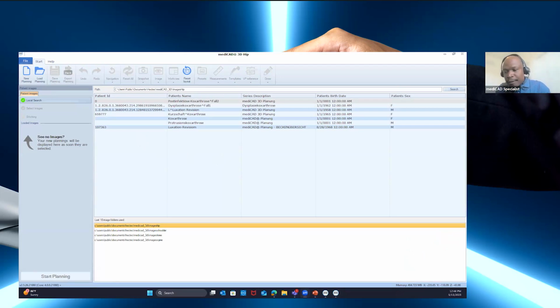If you want a free trial or you want to do a test case, let me provide you my contact information, or you can provide me yours, and then we can set it up. What kind of CT do you need? I think it's just a standard CT. A standard CT works. If it is an X-ray file, it will open, but the X-ray won't be in 3D, so CT only. There's no special protocol for the CT. It's just any CT file.